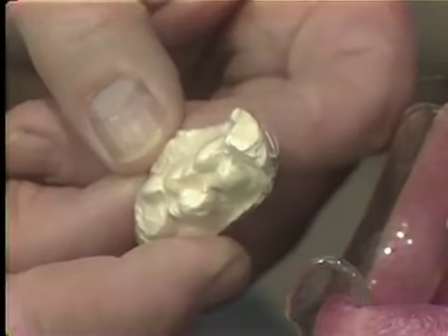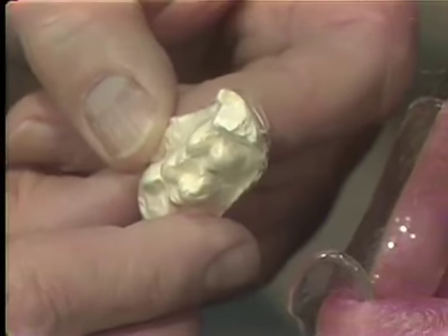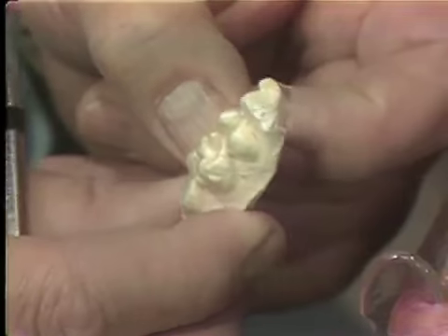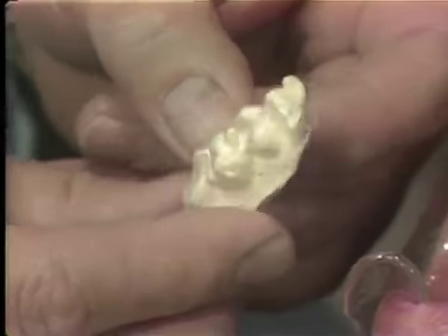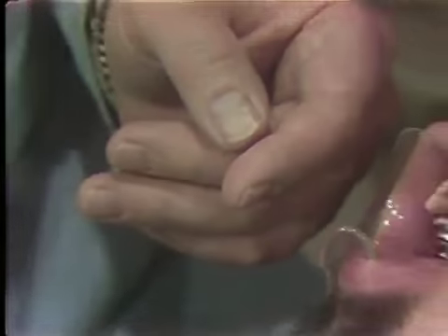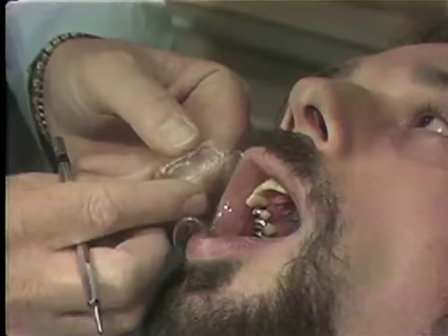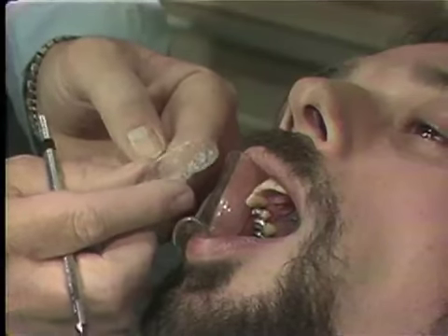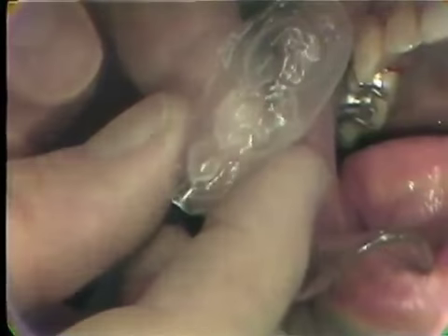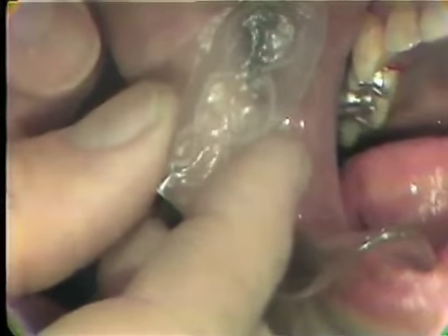We can use the press to suck down a thin shell that we can use to make our temporaries. So here is the shell on the stone model, and here is the thin shell that we will use to form the temporaries. We'll load this up with acrylic Duralay and put it in place to form our temporaries.